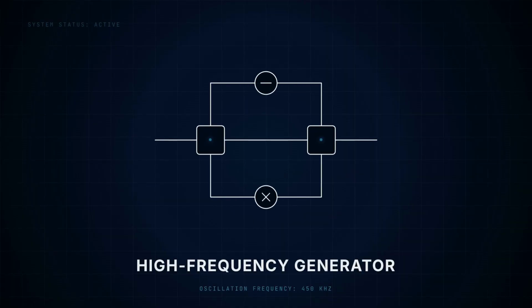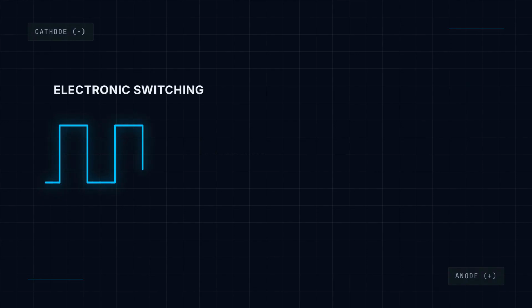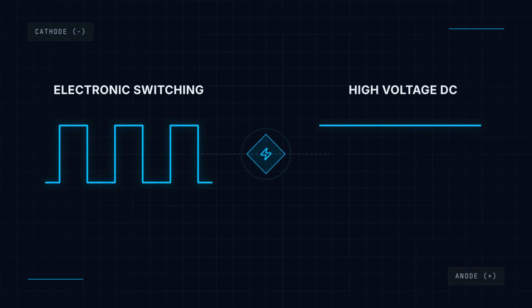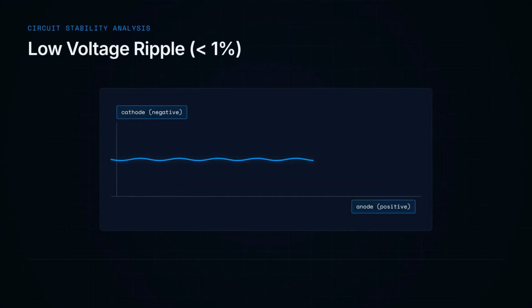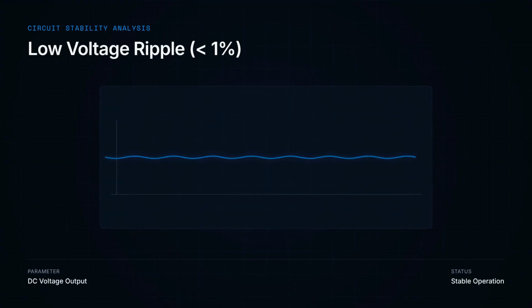Modern X-ray systems typically use high-frequency generators. In these systems, the incoming AC power undergoes several electrical conversions. The voltage is rectified, electronically switched at a very high frequency, transformed to the high voltage required by the X-ray tube, and rectified again before being applied across the tube. This produces a tube voltage with very low voltage ripple. Because the voltage remains relatively close to the selected kVp throughout the exposure, high-frequency generators provide more efficient X-ray production than older single-phase generators.